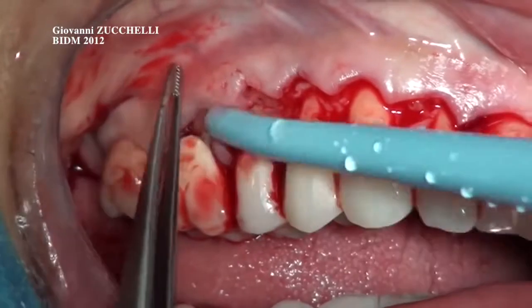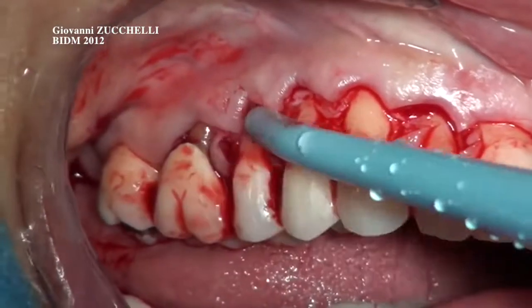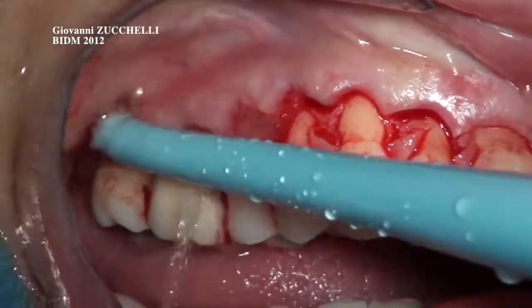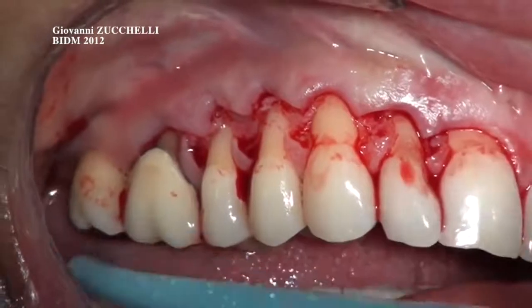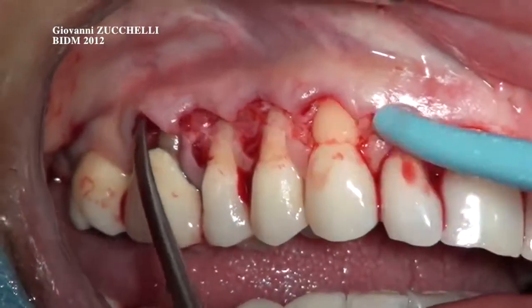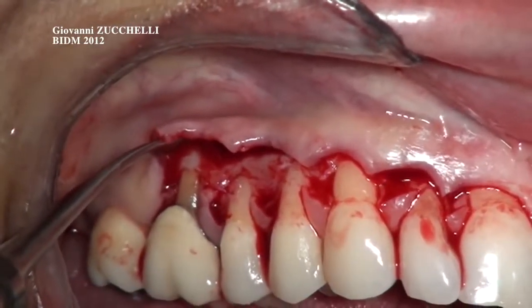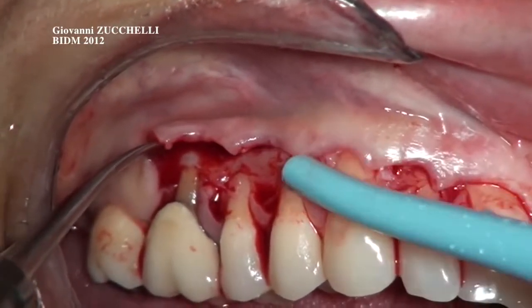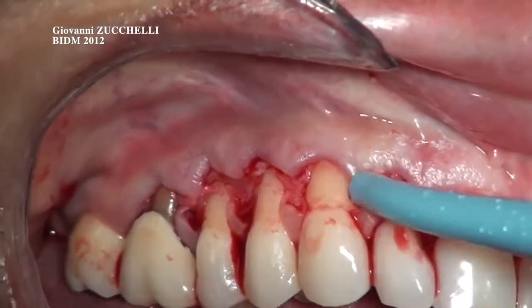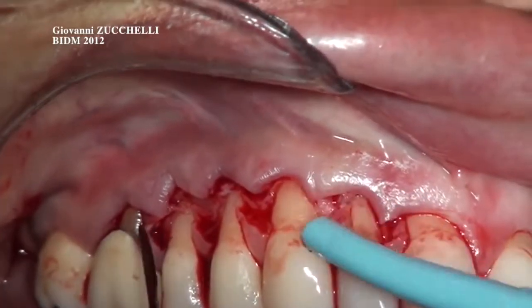We take for a while also the full thickness periosteum elevator. We have some sign in the level of the molar. So you continue the full thickness flap elevation in order to expose the bone crest at the level of the middle root of the molar. You can see the root of the molar. Now you take the knife again and you make the same things you have done in the main portion of the flap.